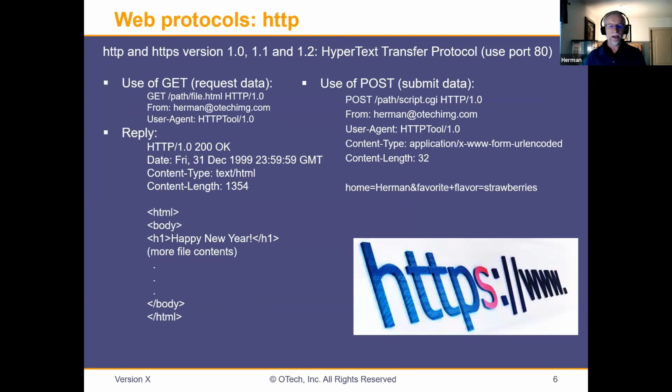Now, first of all, let me back up a little bit. If you don't know anything about web protocols, you might have heard about the DICOM C-store, C-find, C-get, C-move, associate request, and whatever. How does it compare with the web protocol? Well, web protocol is HTTP, right? Everybody says HTTP. I think it's called hyperlinked transferred something protocol. Oh, actually, here's what it says: hypertext transfer protocol, right?